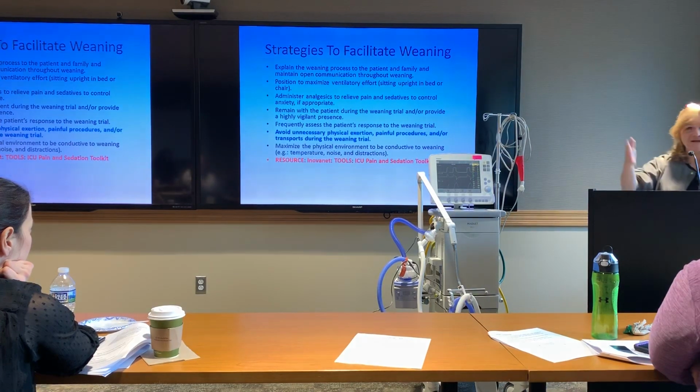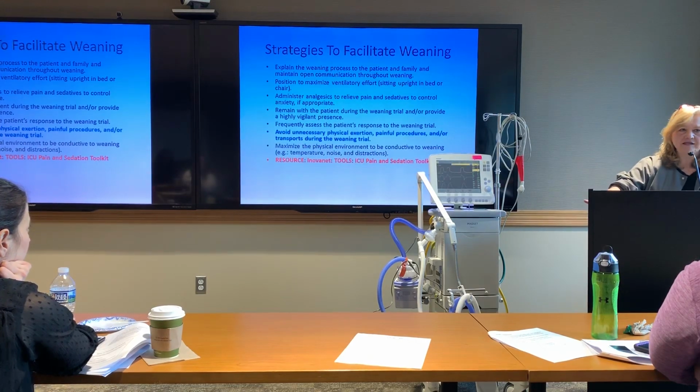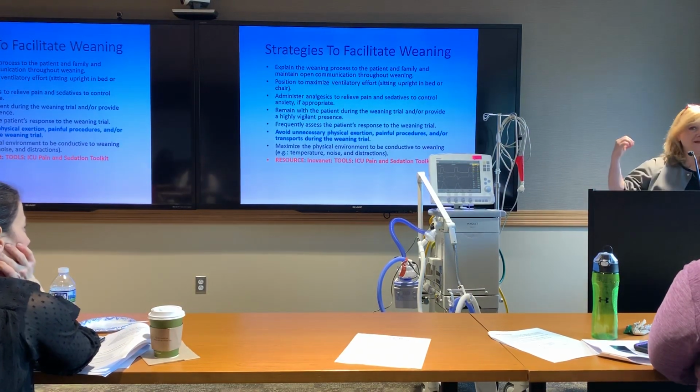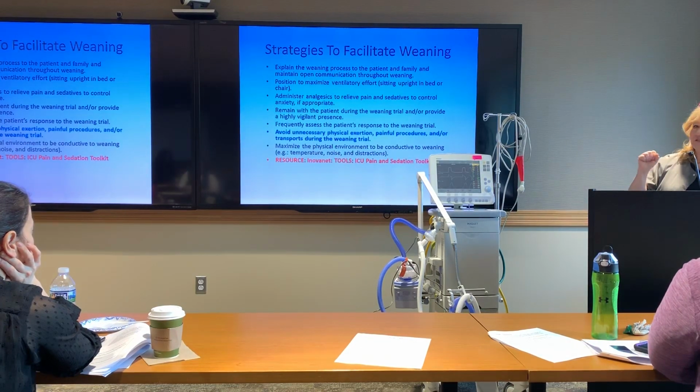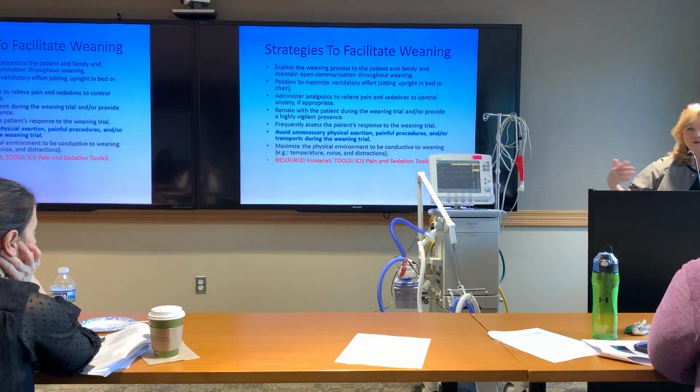Strategies to facilitate weaning. I like this. All right, you want to obviously explain to the patient what's going on, which is good, and the family. Families don't need to stand at the bedside and say, "Just breathe, honey. Take a good deep breath." Are you going to stay here all day and do that? Are you going to do that at home? Because breathing is a normal physiologic response. We're either ready to do it or we're not ready to do it. We don't need to be coached all day long about when to take a breath. It stresses the patient out a little bit. So it's just better: if the patient's ready to breathe, he'll breathe. If he's not ready to breathe, he won't, and we'll come back and try again another time.